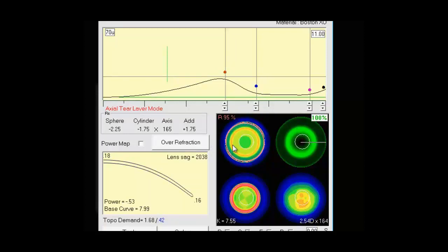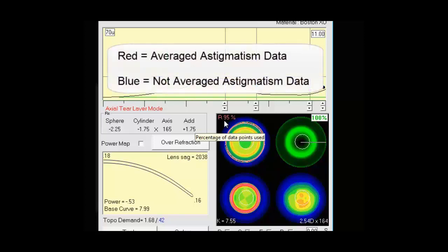Moving over to our quad view display. The upper left as R 95%. The 95% refers to the amount of data points that are used from the topography. The R represents that this is a right contact lens. And you'll notice that it is red. When it's red it means we were prompted to average astigmatism data from the imported topography. And we selected yes to average data. If we selected no to averaging the data that would be blue. And we'll get into that in a little more detail later.